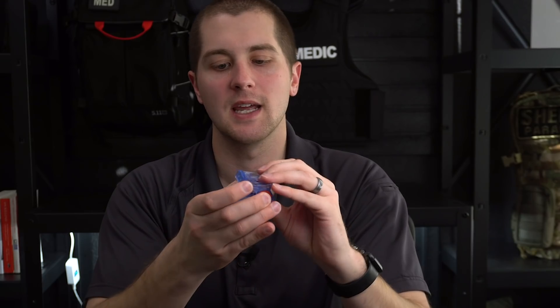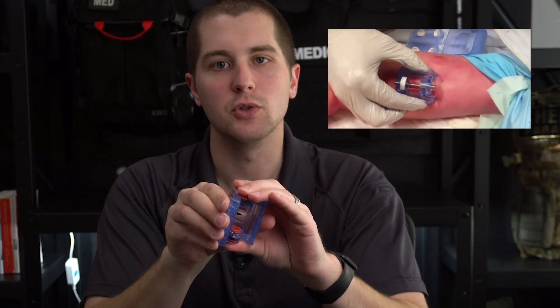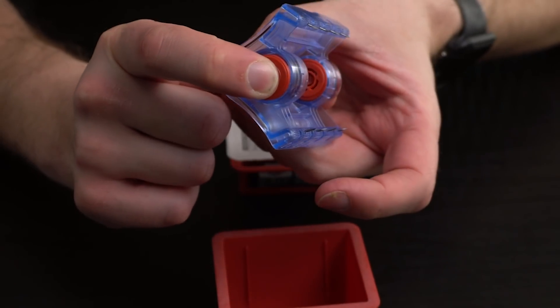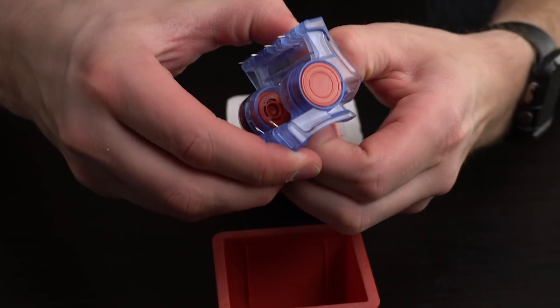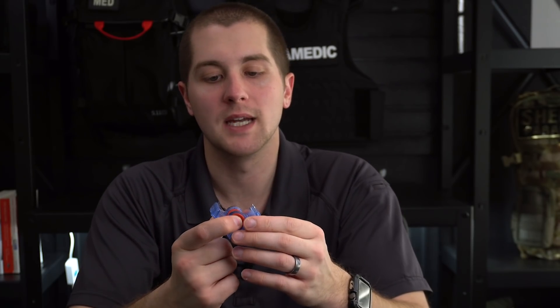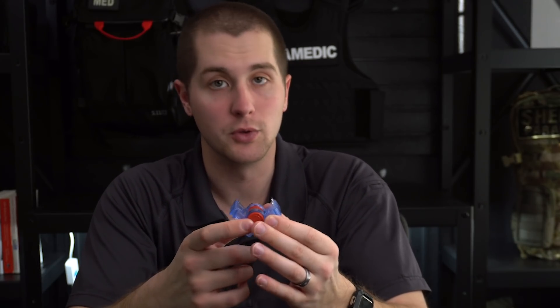What this device is, is a clamp that has teeth on either end of it, and you put these on either side of a massive wound and squeeze it together. It will act as basically like a quick stitch, holding the wound together until they can get something more definitive. The device itself is made of plastic. On the outside, you'll notice that there are four spikes on either end, and they're staggered so the opposite spikes go into holes when it comes together completely. On either side, you have these red buttons, and if you push them together, you can open this. Once it's been ratcheted in all the way, you can open it back up with the use of those buttons.